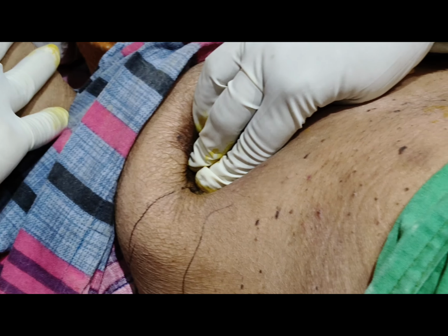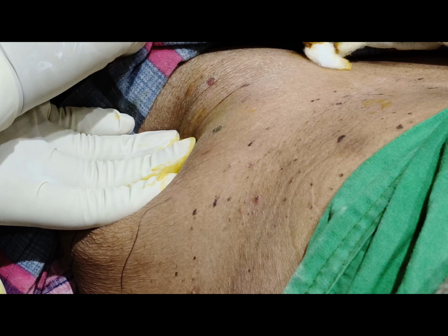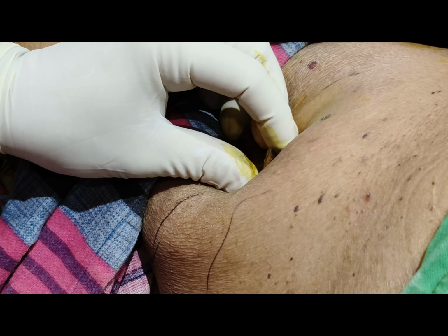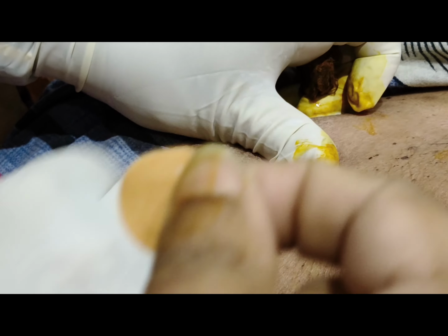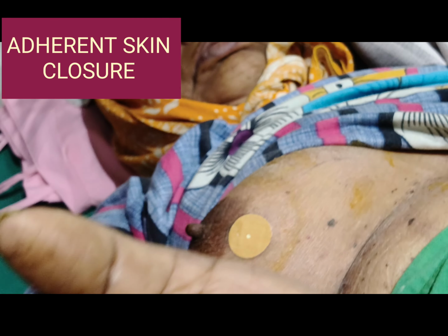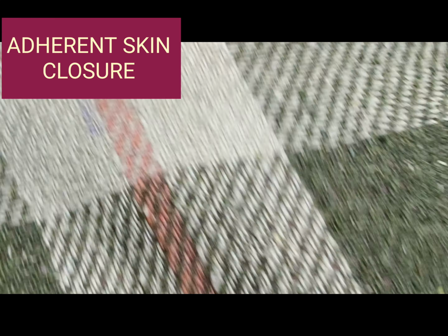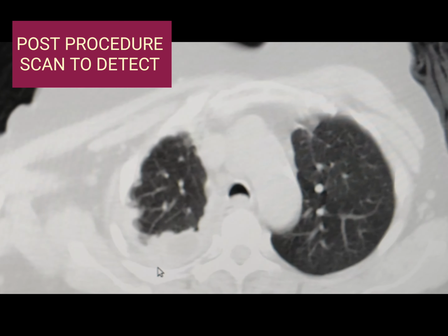So we are collecting the tissues, and at the same time we assess the tumor content on a glass slide. Through the naked eyes we can see the cellularity on the glass slides, and after tissue collection is completed, we close the needle prick site of the wound with skin adhesive and ask the patient herself to press that site. And this is the check CT scan.